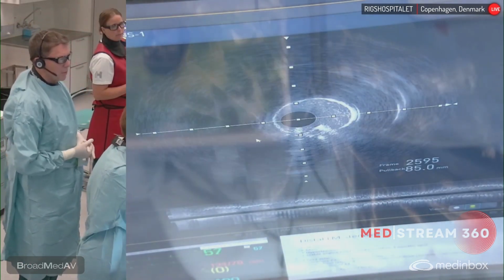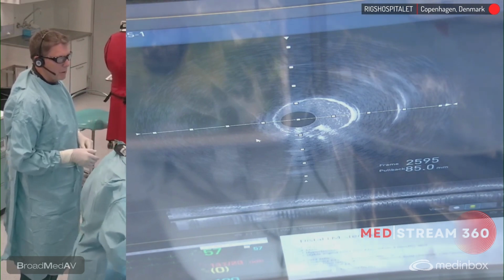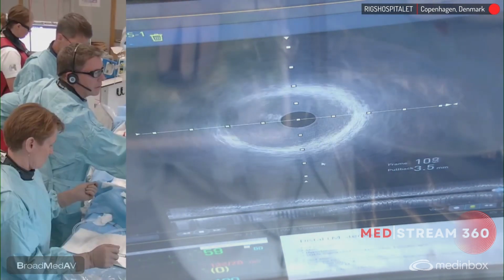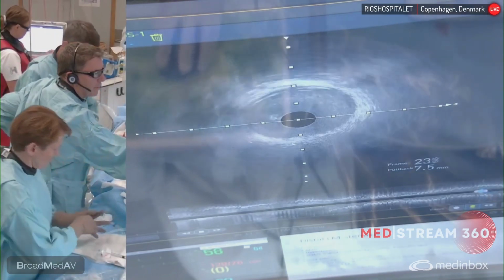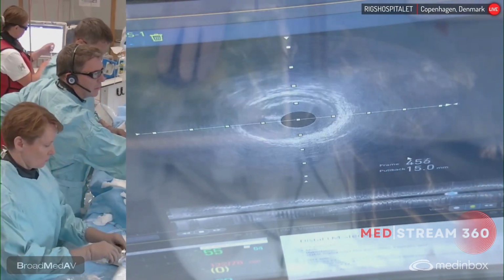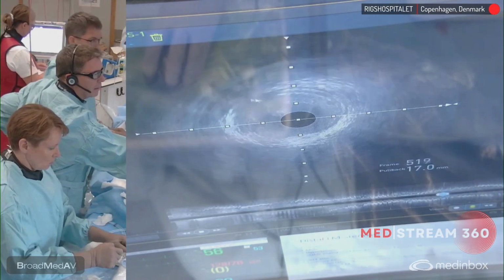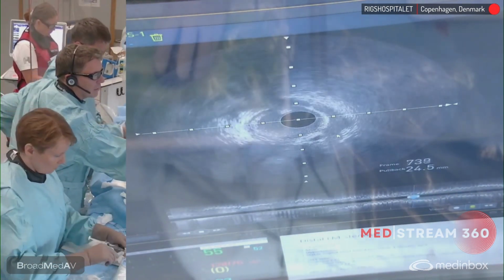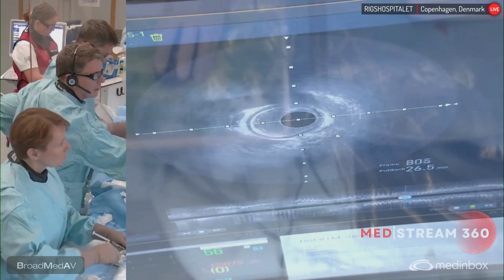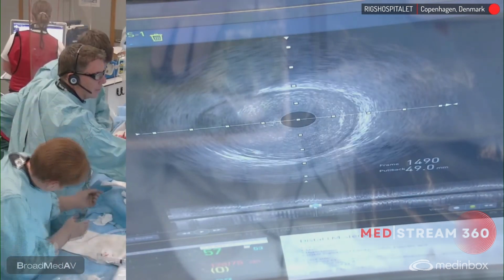So first we will have to see whether it was actually a plaque or some bridging in the distal part. And here, as you see, the distal vessel, it looks quite normal, a little bit plaque here, but not very much. And now we enter in the narrowed area. There was a little bit of plaque here, not that much. Here we have the narrow. Yeah, it's actually bridging. There's not much disease in that. There's a little bit of plaque here, but not that much.